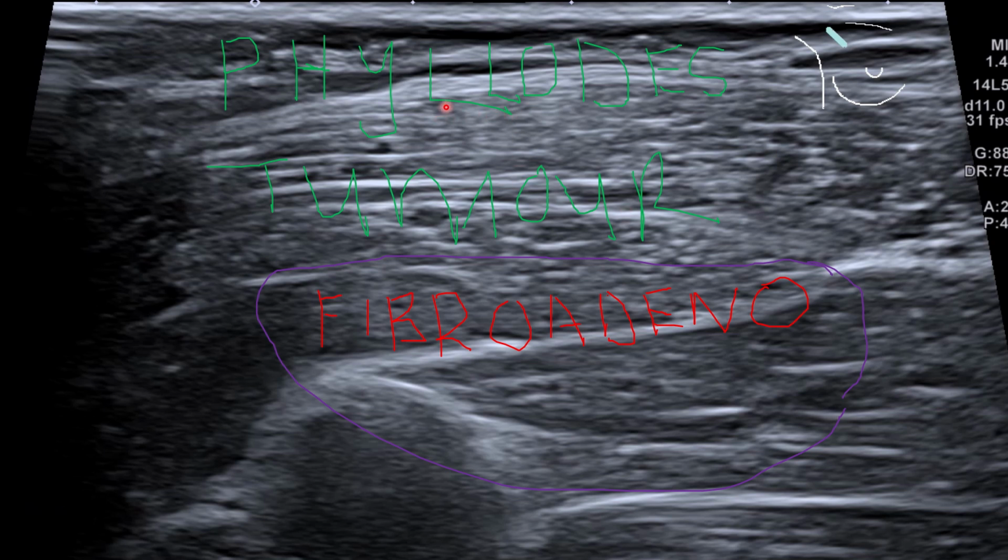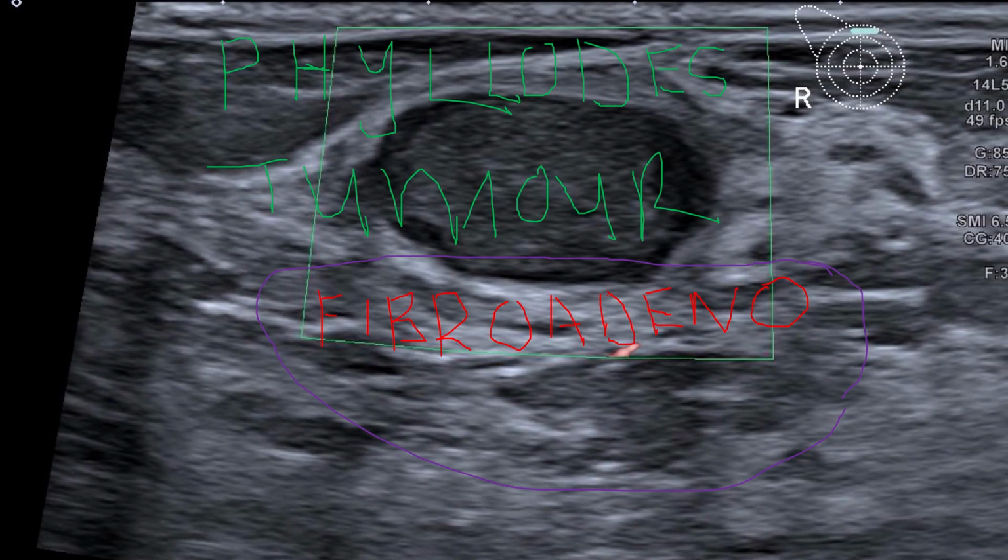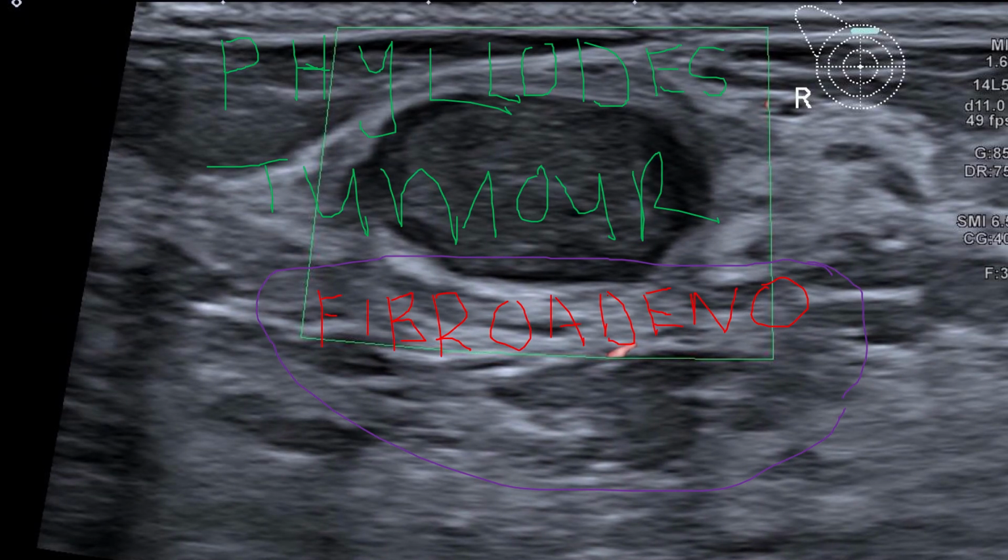Then you have a phyllodes tumor that is now cancerous. That one has the morphology of cancer, and you see all the features of cancer manifesting. That is the major difference between those. So you must know these are rapidly growing tumors. You can also have another morphology that we have to talk about.